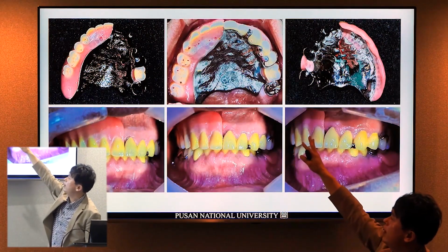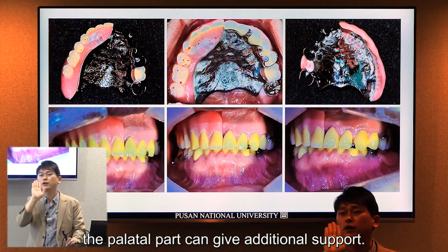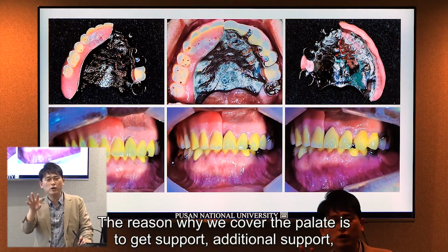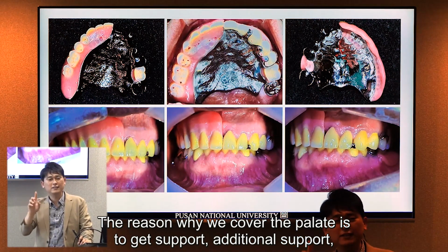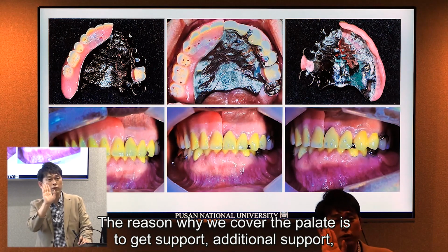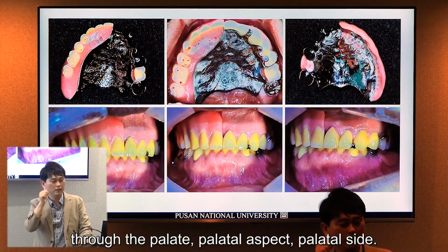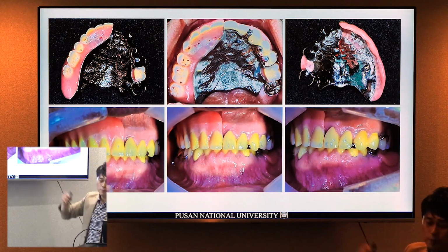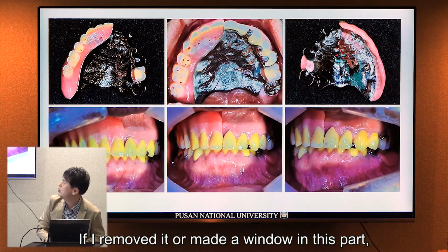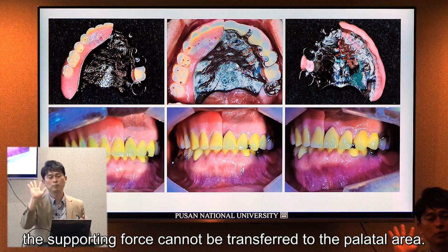And I covered the palatal area totally. The palatal part can give additional support. The reason we cover the palatal is to get additional support through the palatal side. If I removed it and made a window in this part, the supporting force could not transfer to the palatal area.